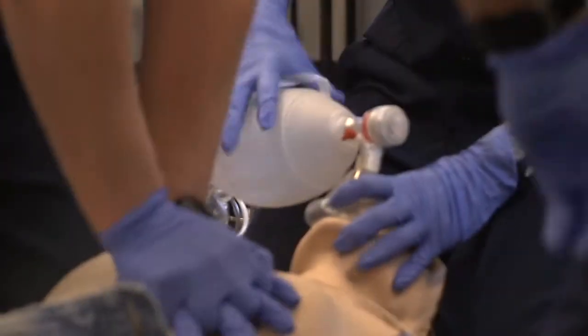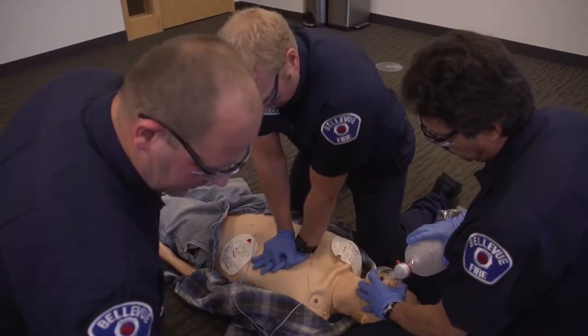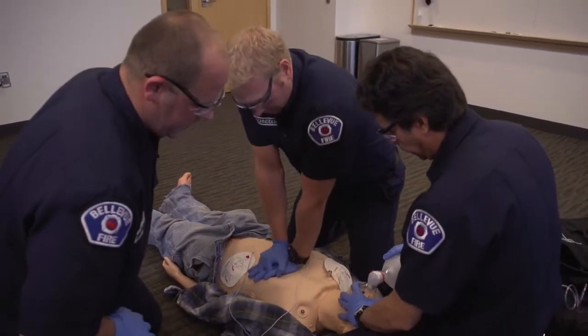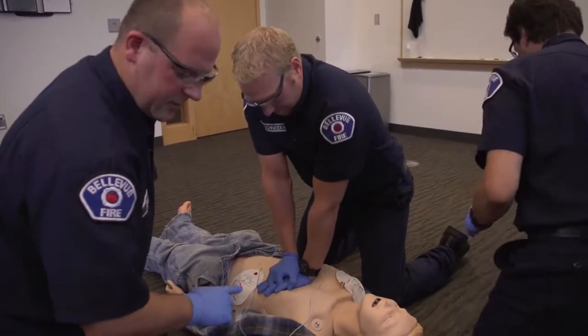I got good respirations on that one. Plug-in connector. 27, 28, 29, 30. Two. Okay, clear off Mario. We'll analyze after this set.